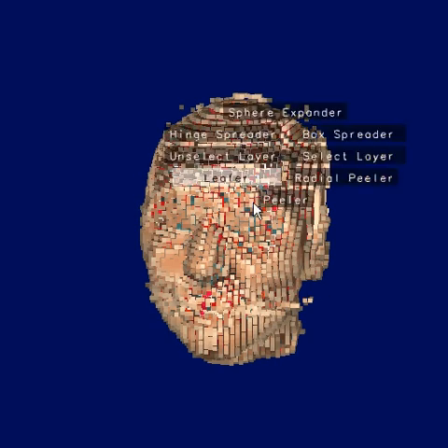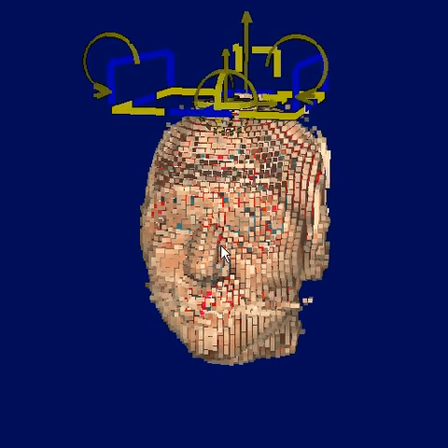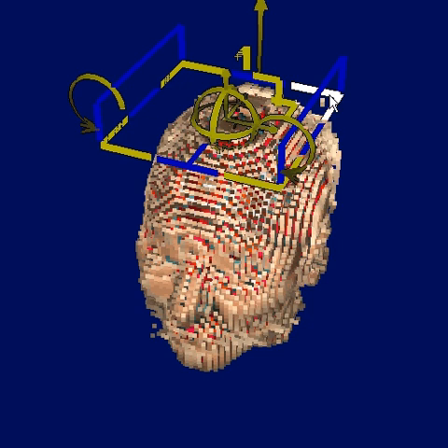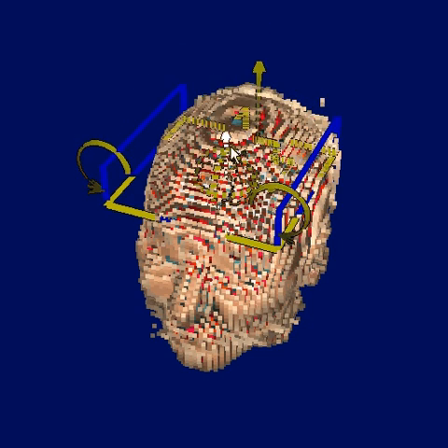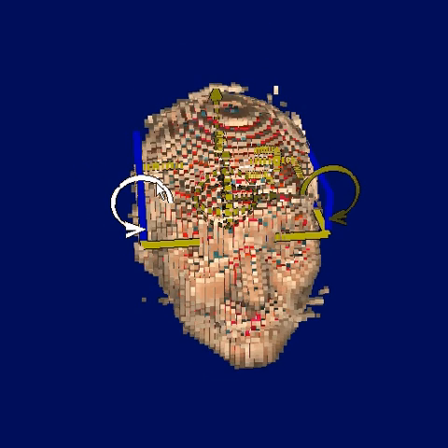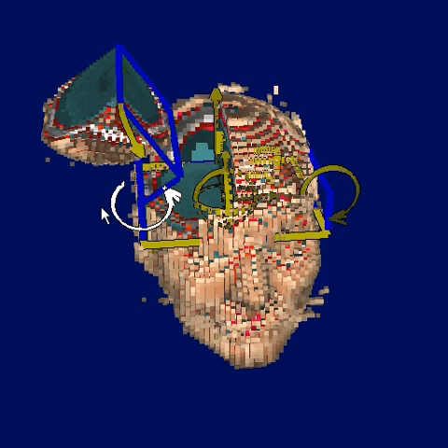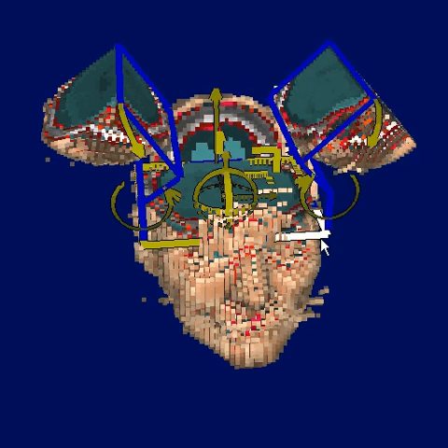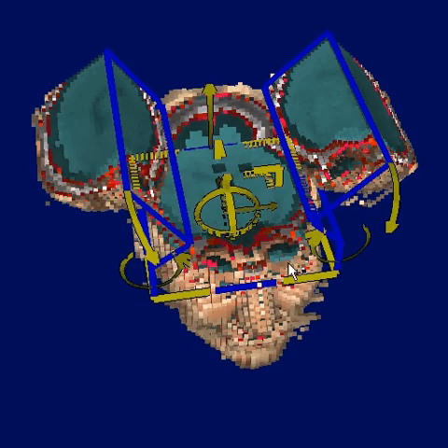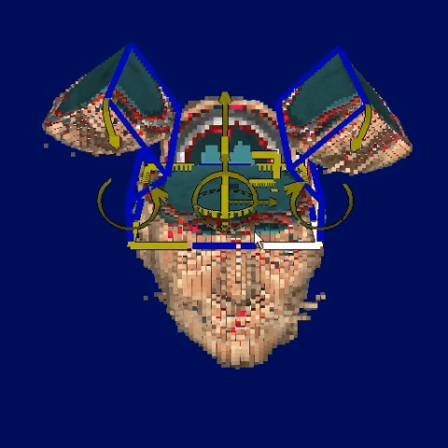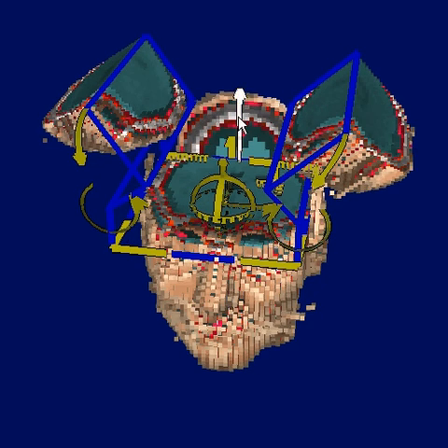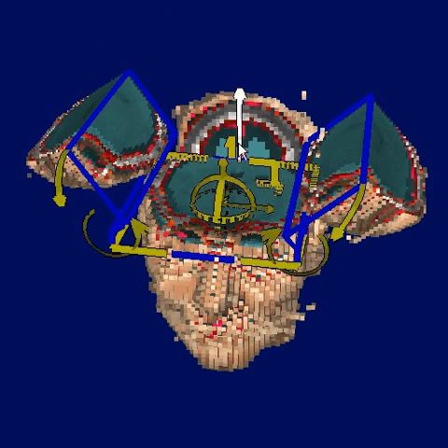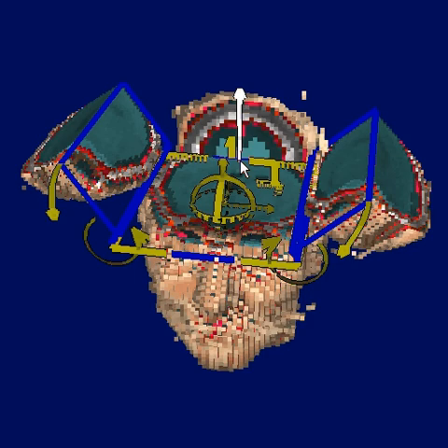Next, I'll select the leafer tool. This tool is shaped like a tray. It has a base and rectangles on either side of it. It also has these arc-shaped widgets which can be used to hinge open each half of the tray. The voxels that are hinged open are rotated around the top edges of the sides of the tray. And we can change the depth of the tray using this arrow at the back.